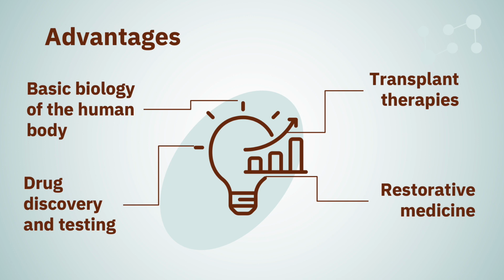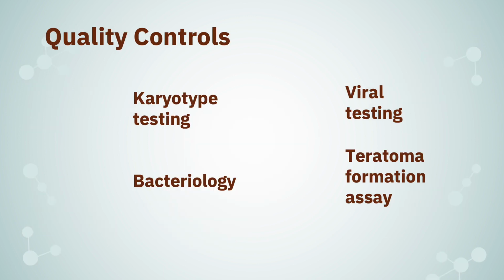There are many quality control tests run to make sure that the stem cells are not contaminated and have not been differentiated. The four you see here on the screen are just a very small but important sampling.